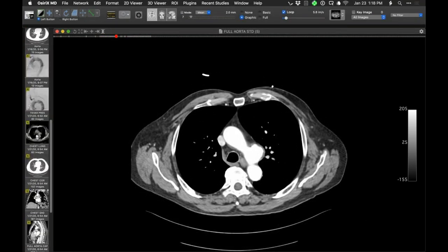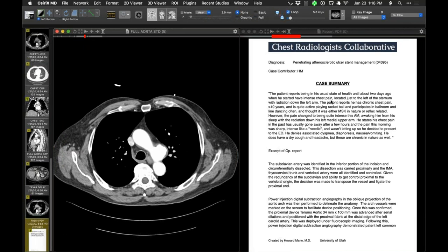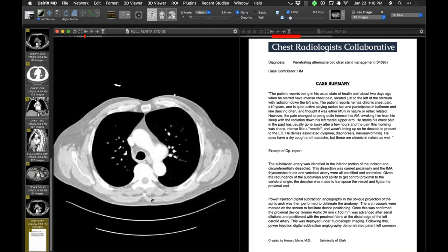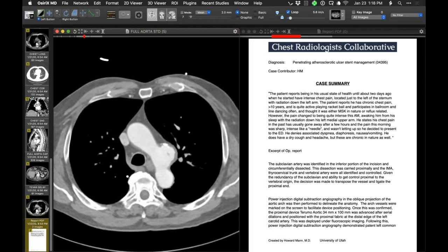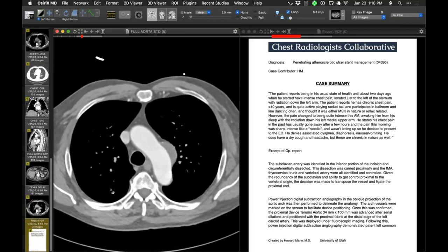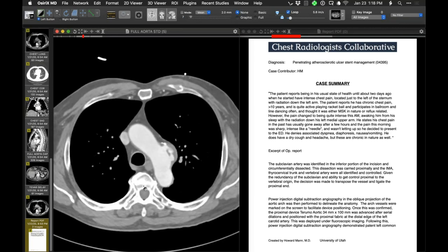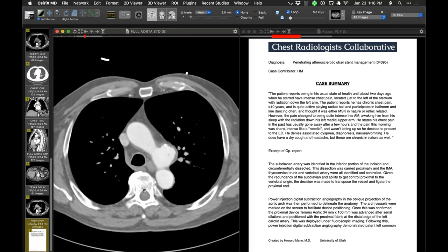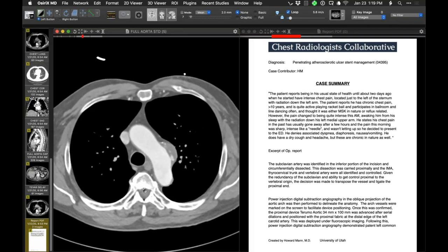The history here is a person who came in with chest pain located to the left of the sternum with radiation down the arm. He has chronic chest pain, but this was acute and rather intense. In the context of that, he was imaged with a CTA, and here is a lesion which was interpreted as a penetrating atherosclerotic ulcer. It's certainly a very focal abnormality, with some thrombus or abnormality related to the wall.